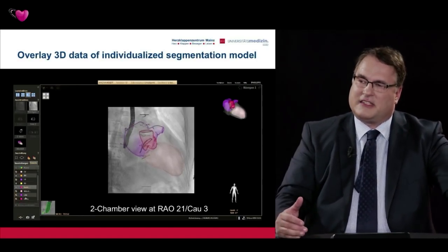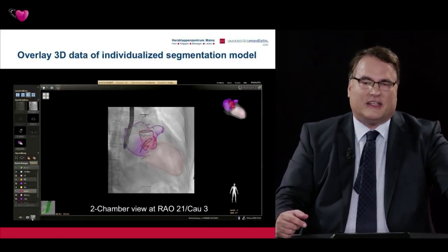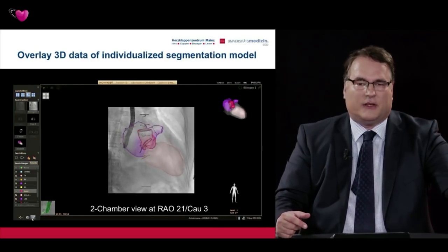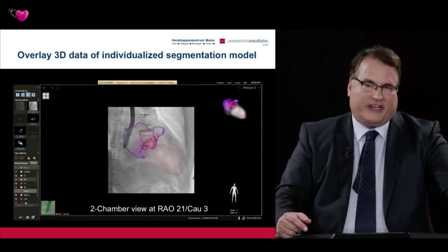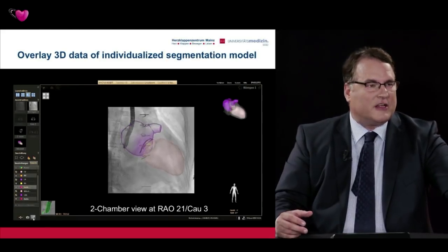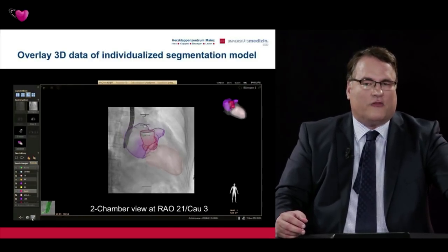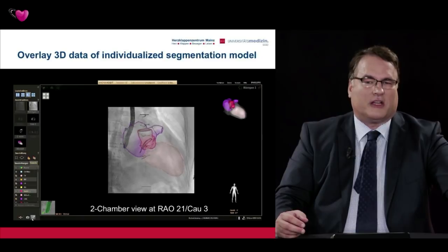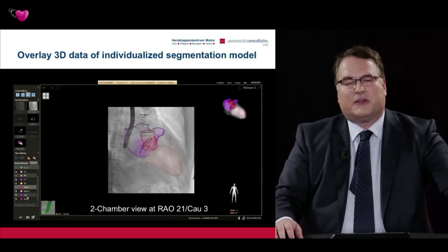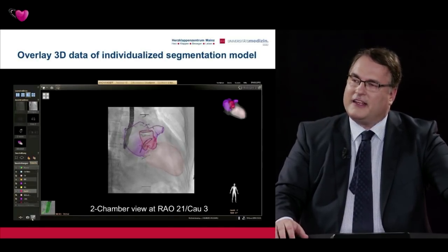If we stick here perhaps, because I think there's another thing that is quite interesting for our viewers, because this is a webinar on transcatheter repair or replacement techniques, and this is that we have an overlay in this projection, which is widely used, of the aorta and the mitral ring. We chose to show you somebody with a complete mitral ring. As you can see here, it's coming as an overlay. Now it's moving with the model. Now it's not moving because the fluoro is put on and off. But you can nicely see that the aortic root is actually overlaying the mitral.